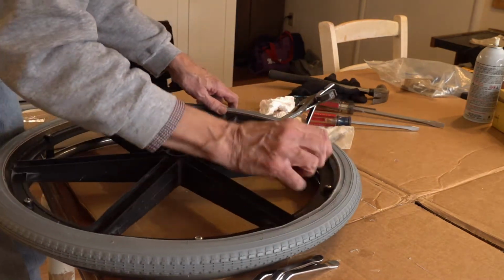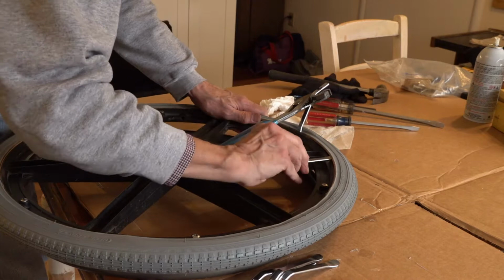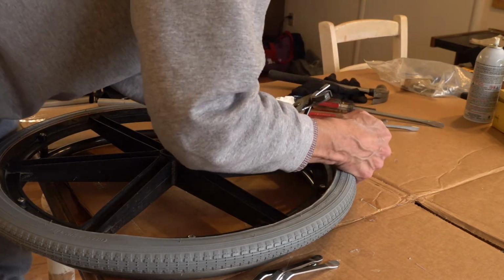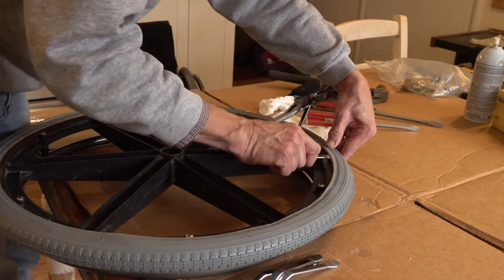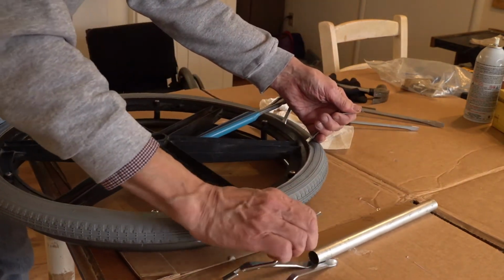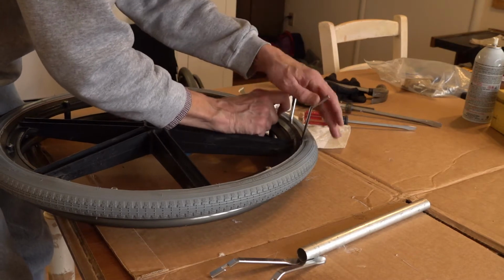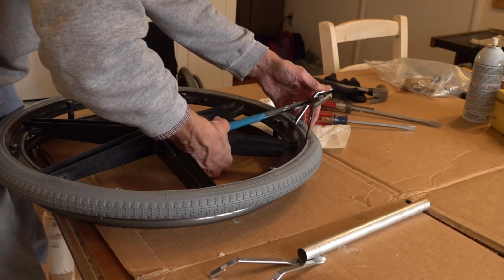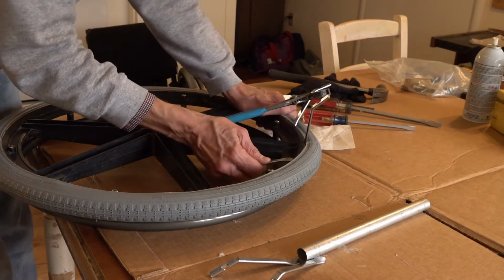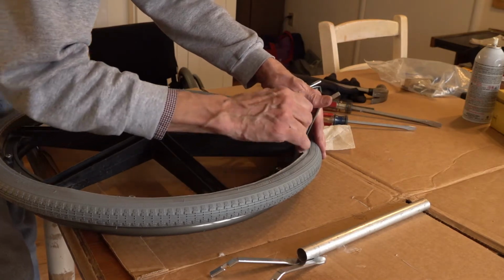And then I just work incrementally around here, as you would for a regular tire. Okay. You do have to take it in small chunks. Don't want that to come loose on me. Some people can do it with tie it down with cable ties or such thing to hold that in place. Don't try to do it too much at a time.